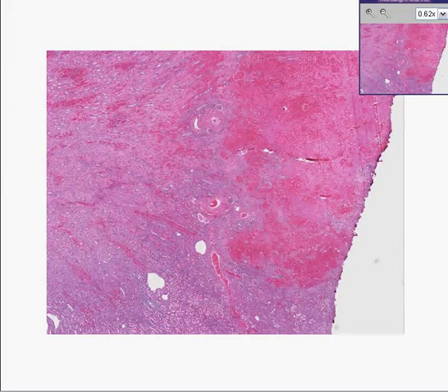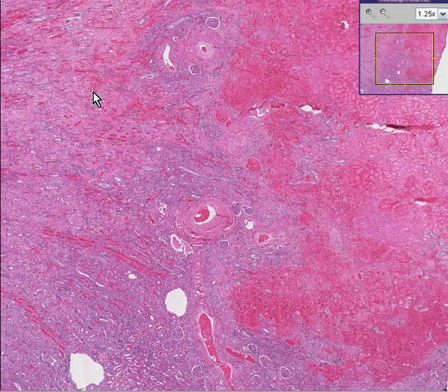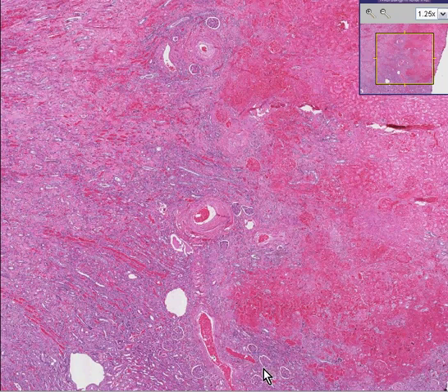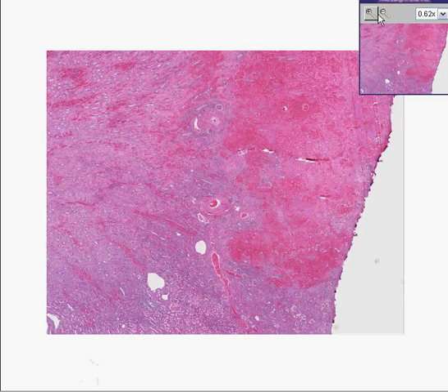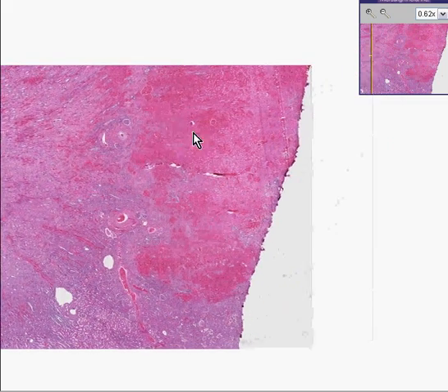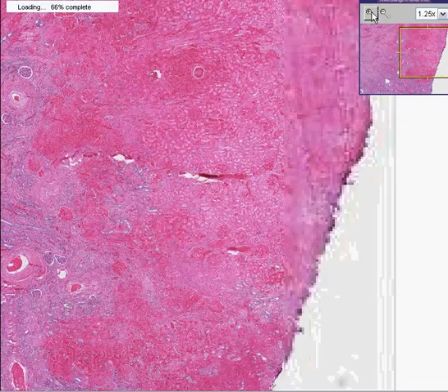Here is another case, and I think we could recognize this once again very quickly as being a kidney. You can see glomeruli here, all throughout here. You can see a lot of tubules here. But in addition, you can see a very distinct and fairly wedge-shaped area of hemorrhage and necrosis out at the more outer cortex.